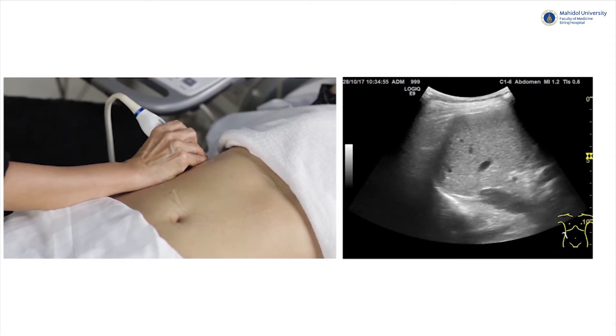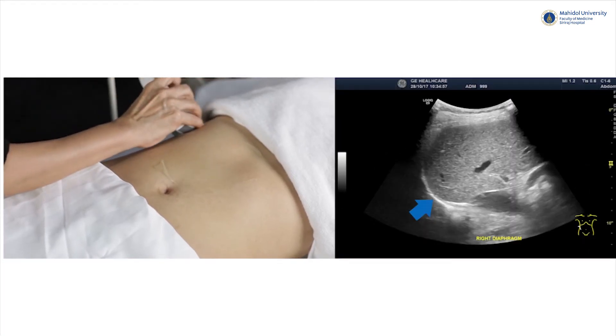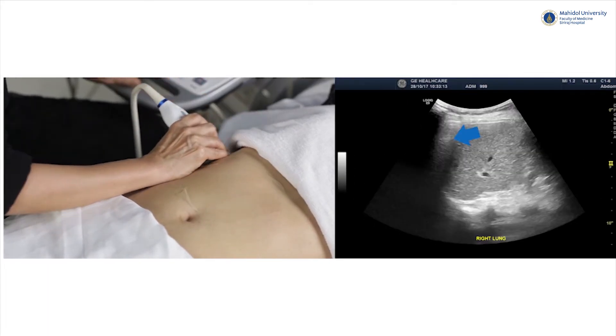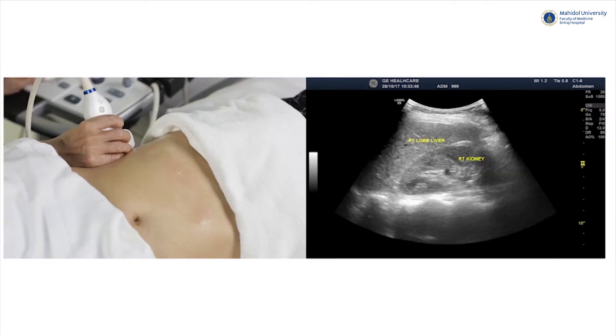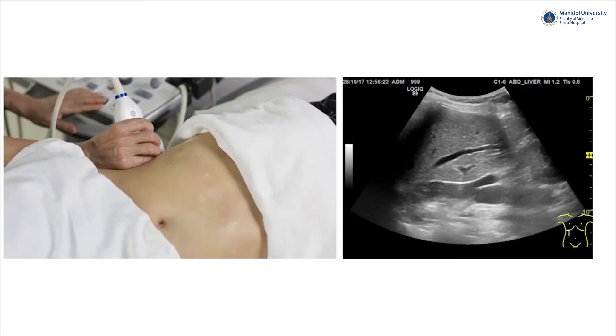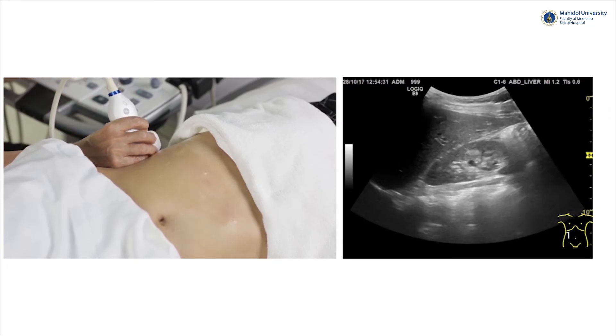Scan the right lobe up to the diaphragm, which appears as an echogenic line, and also scan up to the right lung, which will be shown as bright lung echo. A longitudinal scan at the anterior axillary line — the right hepatic lobe will have an acute angle of about 75 degrees, and the tip of the right hepatic lobe should not be beyond the level of the right kidney pole. A normal liver parenchyma should have homogeneous echogenicity, slightly higher than that of the right kidney.